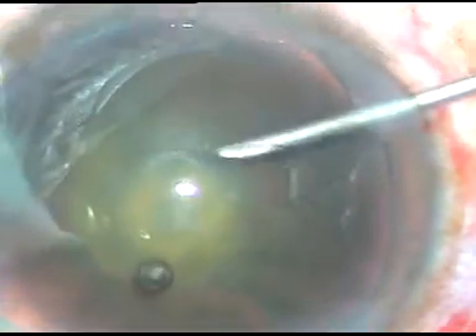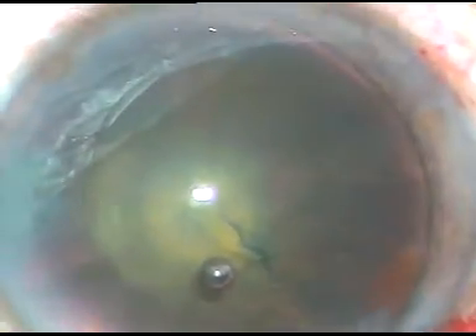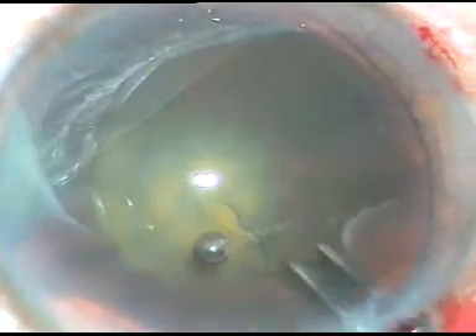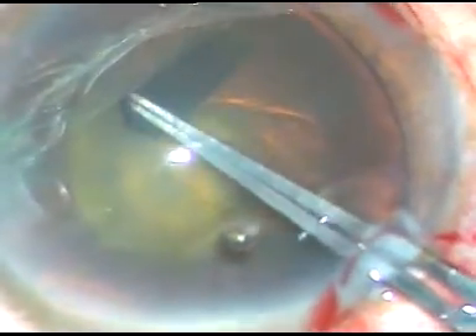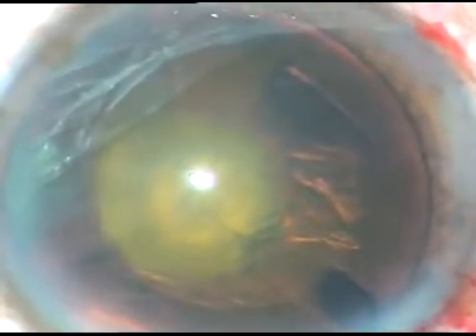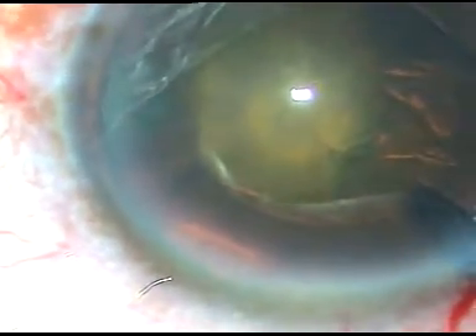The capsule is incised with a 26-gauge bent needle. A nice capsular tag is made. This capsular tag is held without force. I go slowly, anticlockwise all around. I try to be at equal distance from the margin of the pupil. And thus, I get a very nice round rhexis. This has been a very satisfying capsulorhexis — it is almost 5 mm in size.